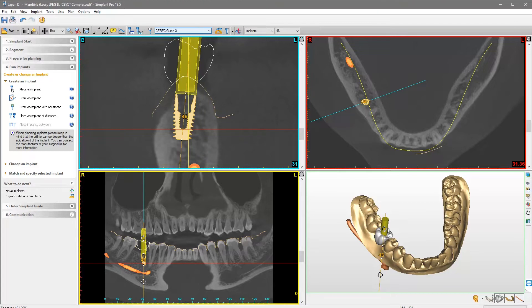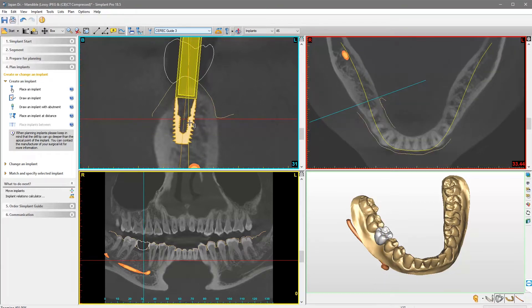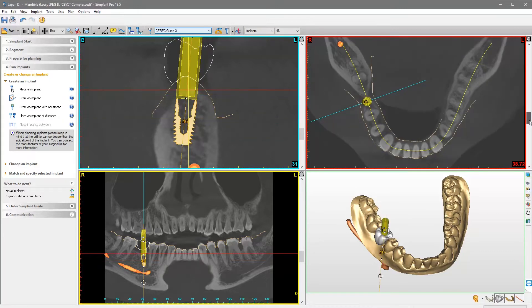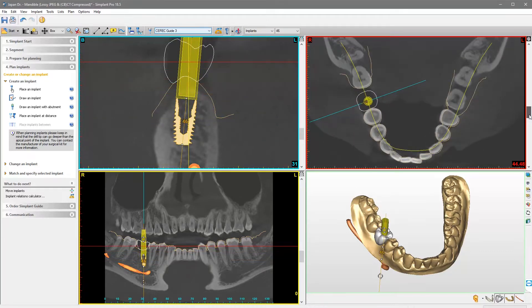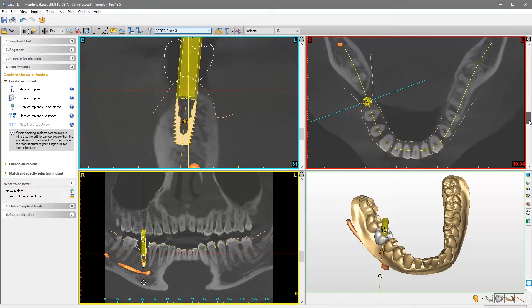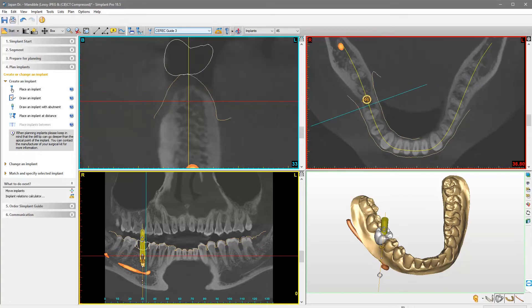Move the mouse on top of the implant body, and click and hold the left button to drag the implant to a new location. We check in the axial view and continue in the panoramic view.